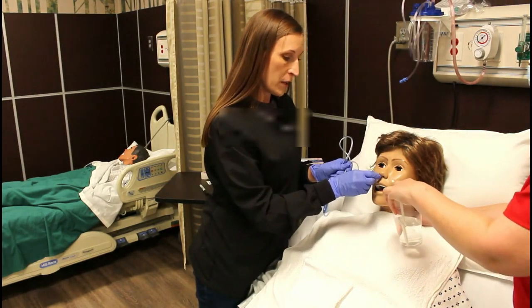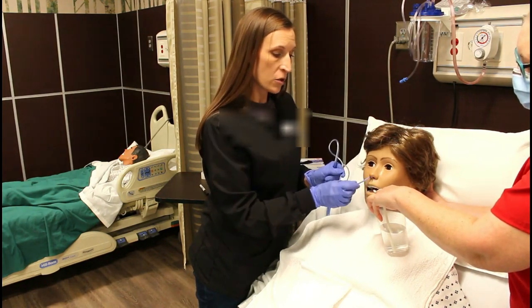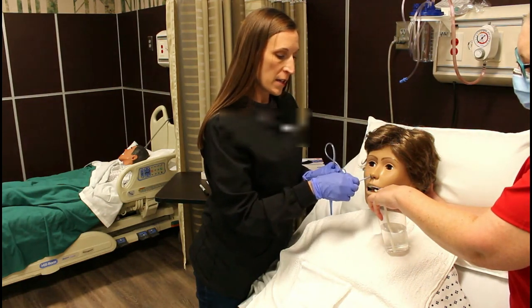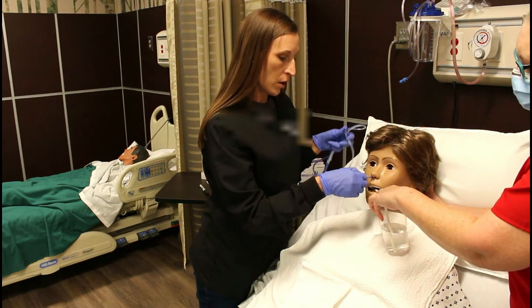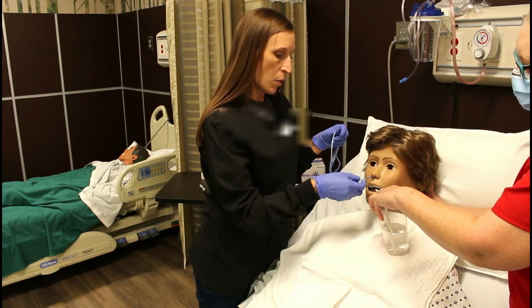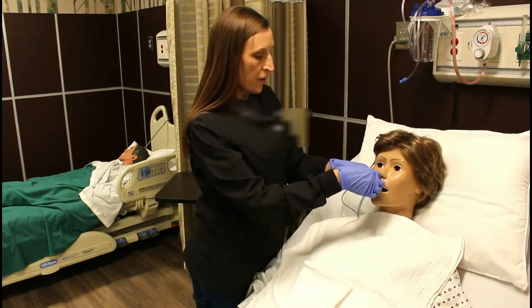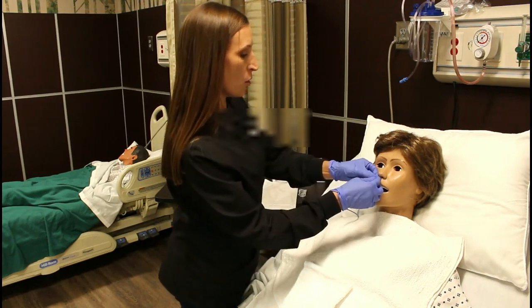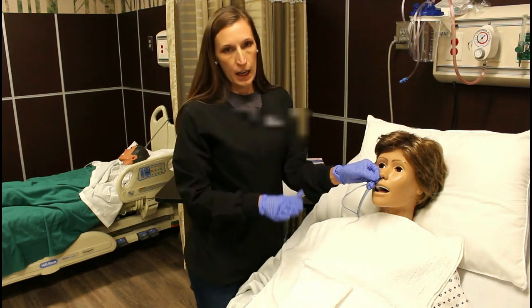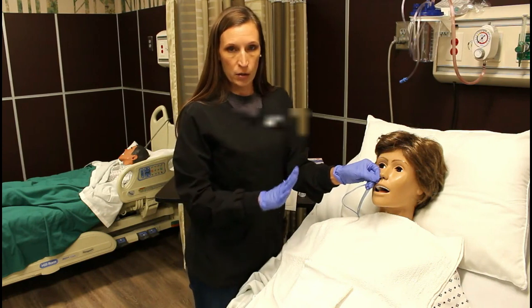Okay, now bend your head down to your chest and take small sips of water. I'm going to advance the tube — swallow, swallow, about five centimeters at a time. Swallow. Okay, I've got my mark — now we can relax. If at any time the patient is uncomfortable or starts to have a lot of coughing and choking, you can pause for a second and let the gag reflex recover. Once you stop moving the tube, the gag reflex will go away.